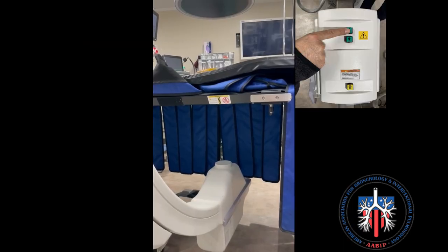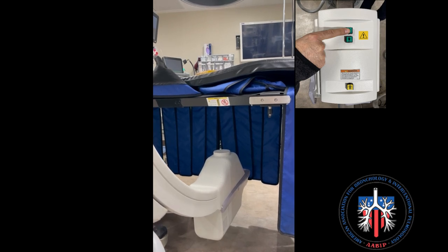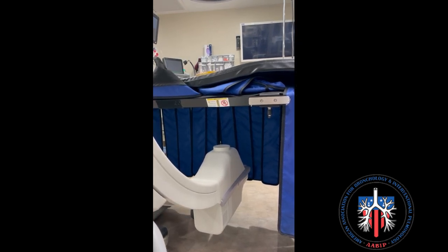To move the X-ray tube up or down, press this button. It is always desirable to have the tube as far from the patient as possible.